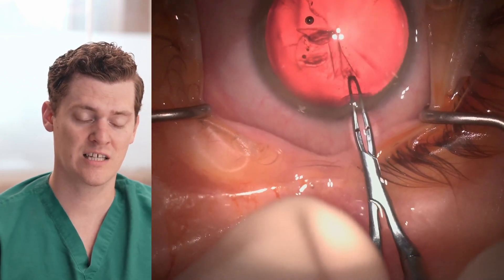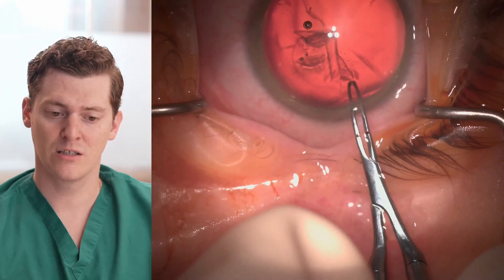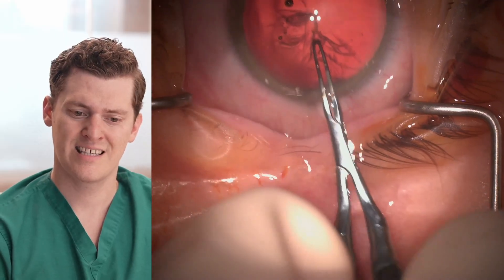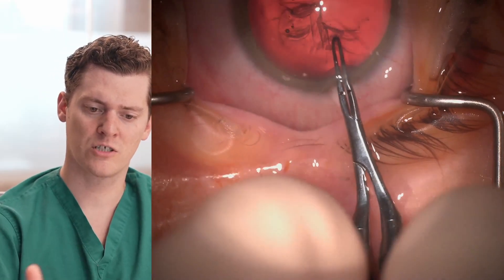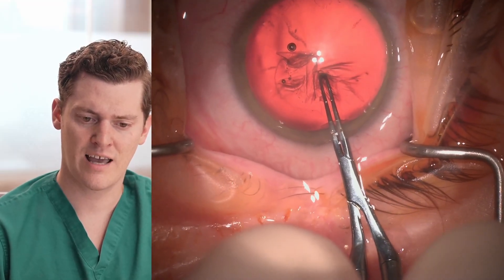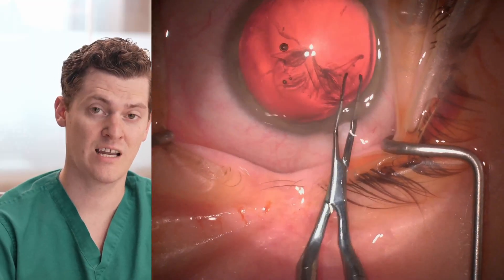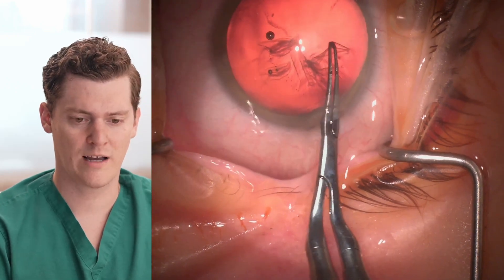In this situation, having a very dilated pupil helps me diagnose this and determine that I should be able to extend the capsulorhexis all the way around. So I grab it using the technique of not only pulling centrally, but almost pulling in the opposite direction, which gets that capsulorhexis edge to come a little bit more centrally. I grab again, and you can see that edge really come back into view.